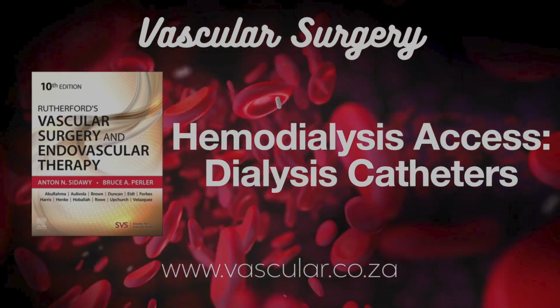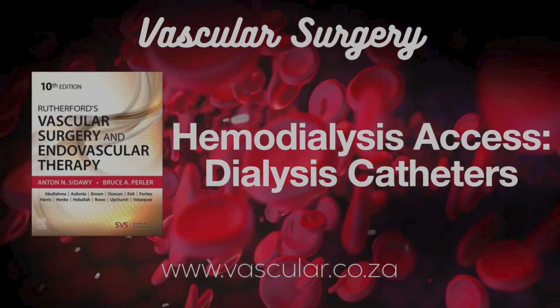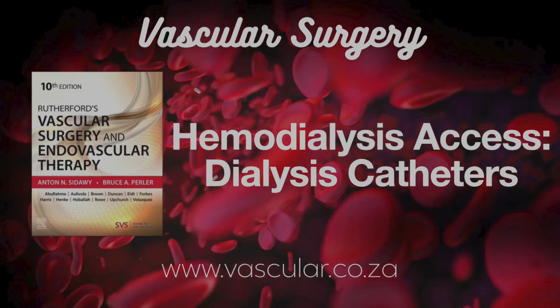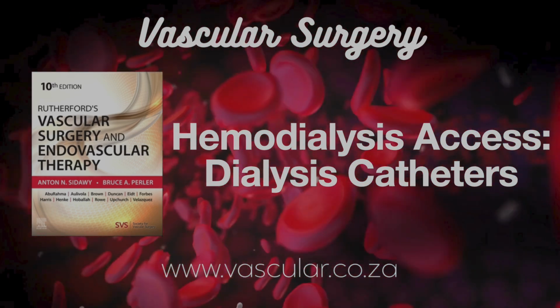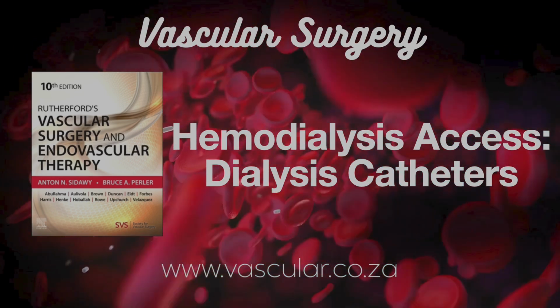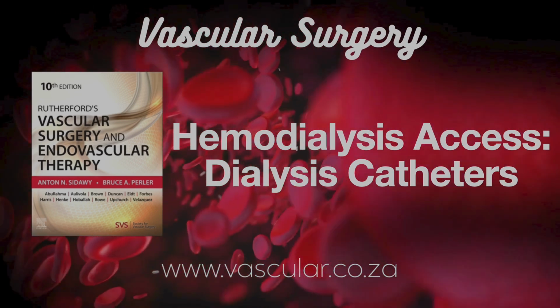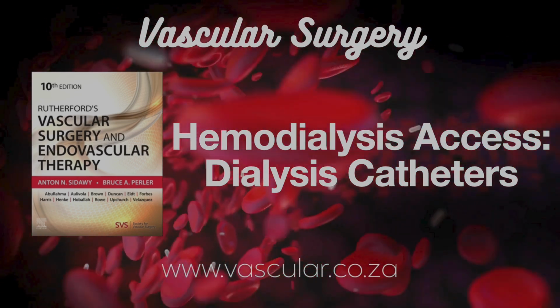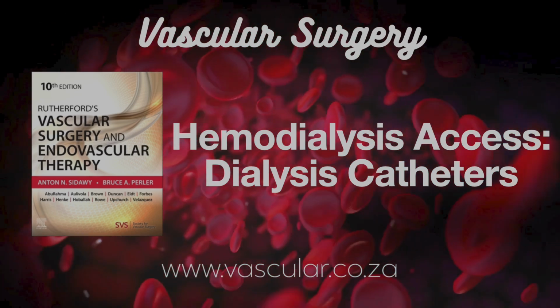Okay. History and physical. Check. What about imaging before the procedure? Yeah, preoperative imaging is really valuable. Helps us see if the target veins are open and spot any potential roadblocks before we start. What's the first step usually? Often, it's color flow venous duplex imaging. It's basically an ultrasound. Non-invasive, easy to do, great for checking out the jugular veins in the neck and the axillary veins near the shoulder. But limitations? Yeah, it struggles to see deep into the chest. The lungs and bones get in the way, making it hard to visualize those really central veins like the superior vena cava.